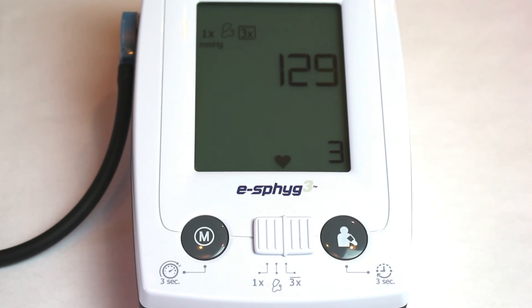To take an average reading with only two measurements, cancel the third sequence by pressing the Start-Stop button. Then press the Memory button to view the average data from the first two readings.